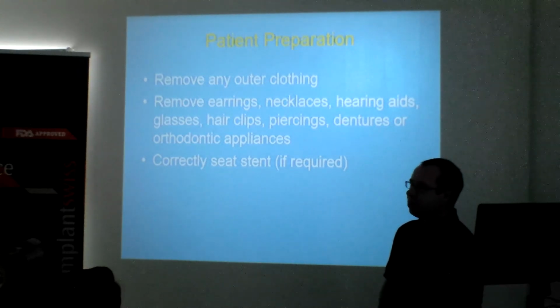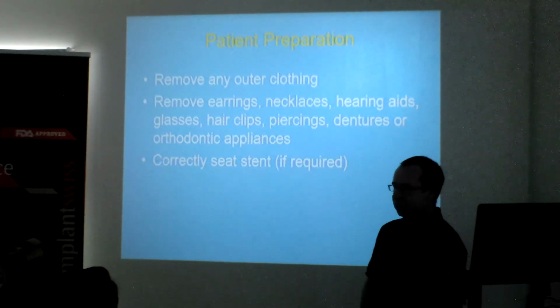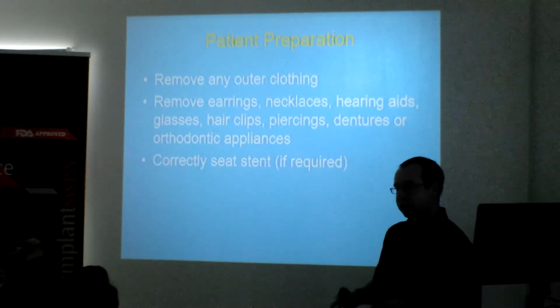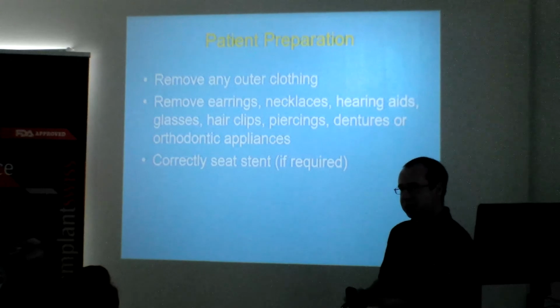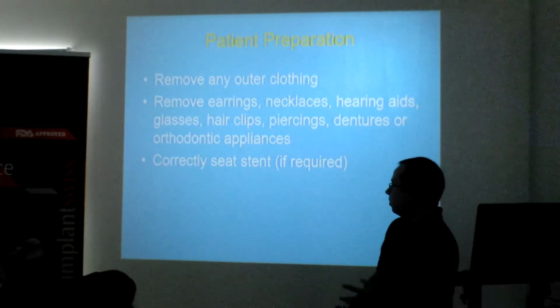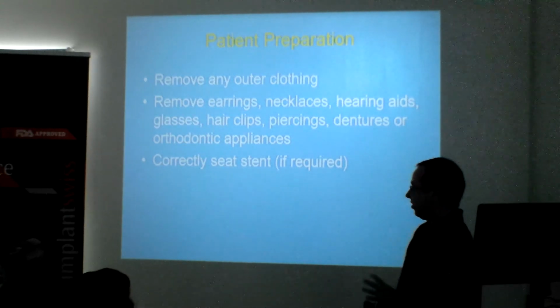So guys, barium sulfate, you can get it from a dental supplier, incorporate that into your acrylic, a denture or anything which the patient is wearing, and that's the best stent you can get, because if you're going to do amalgam, I think you're going to cover that here. Yeah, it causes scatter and beam hardening, so it degrades image quality. So even barium will to a certain extent, but not as much as in other circumstances. So always make sure the stent fits the patient. Very, very clear on that. Always make sure it fits.